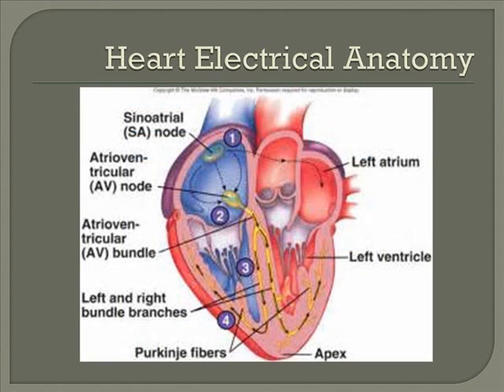So now we'll take a look at some more specific anatomy that EKGs deal with. EKGs do not tell us how well the heart is pumping. It specifically tells us how well the electrical activity is occurring inside of the heart. Whether or not the heart actually contracted is not something we can determine from an EKG. That requires other methods.